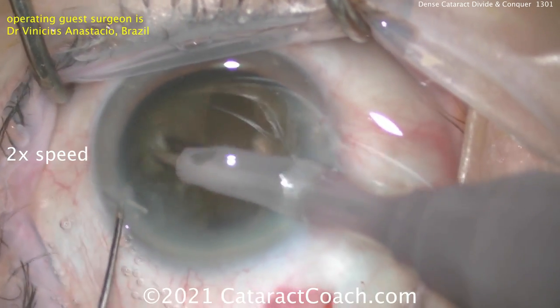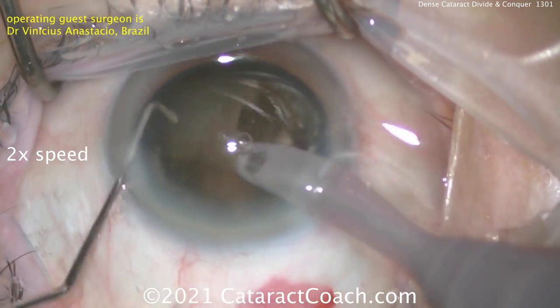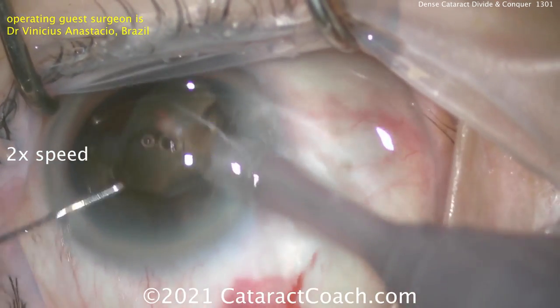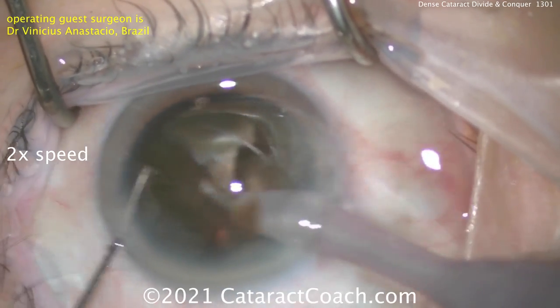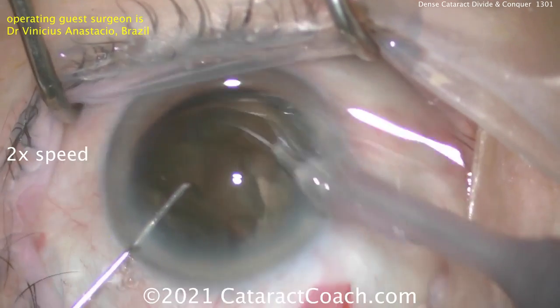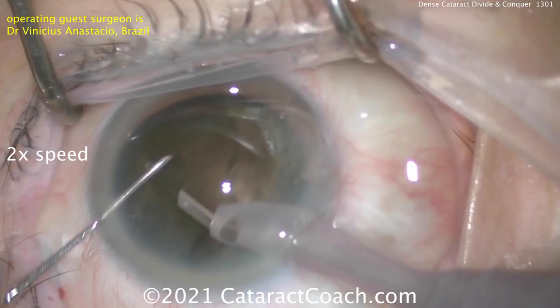He's checking to see how deep he is, and once he's sufficiently deep, really separating the piece. I like that he holds one piece with the phaco probe in high vacuum in order to separate it. That first quadrant is removed. Once the first quadrant comes out of the eye, it's going to be a lot easier to get the rest out. Very efficient.